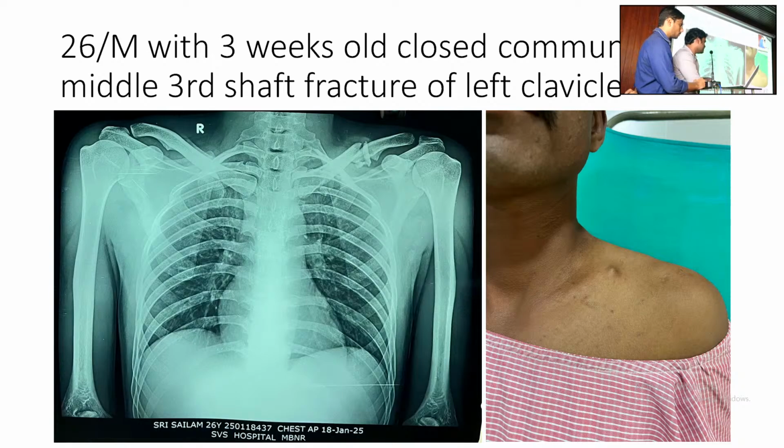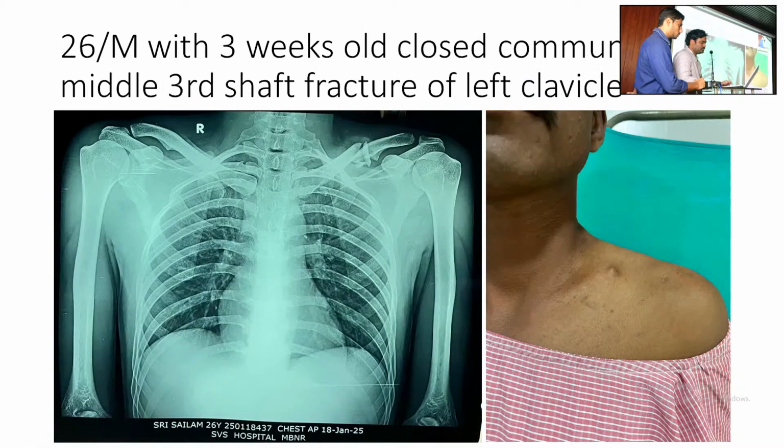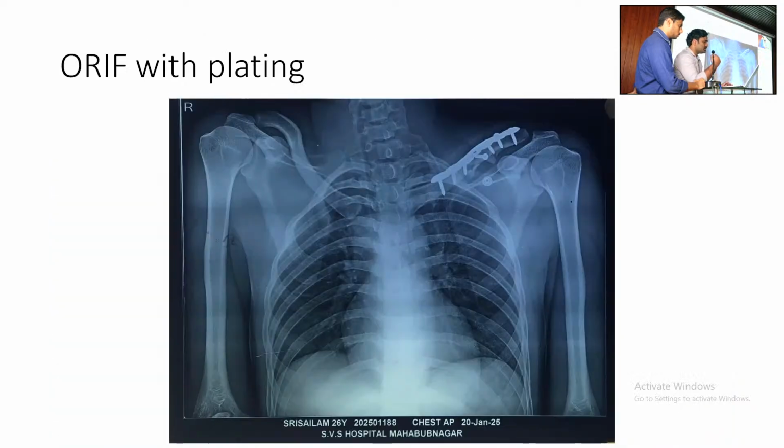This vertical fragment impinges the skin, sir. This was the clinical picture of the patient. Denting of the skin. We have done open reduction internal fixation with a 7-hole clavicular plate, sir, with interfragmentary screw. Superior to the clavicle.